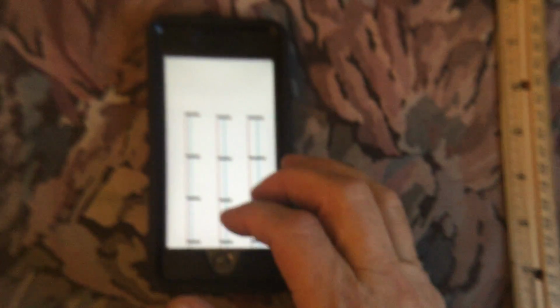Initially, on the first step of the reading, you'll notice our first step is to always find a thermometer in the middle where a central white space is persisting after several quick pull-in releases. You'll notice on the one narrower to it that even though we can bring out the central white space, it's disappearing after the release, demonstrating that it's still a non-central white space segment.